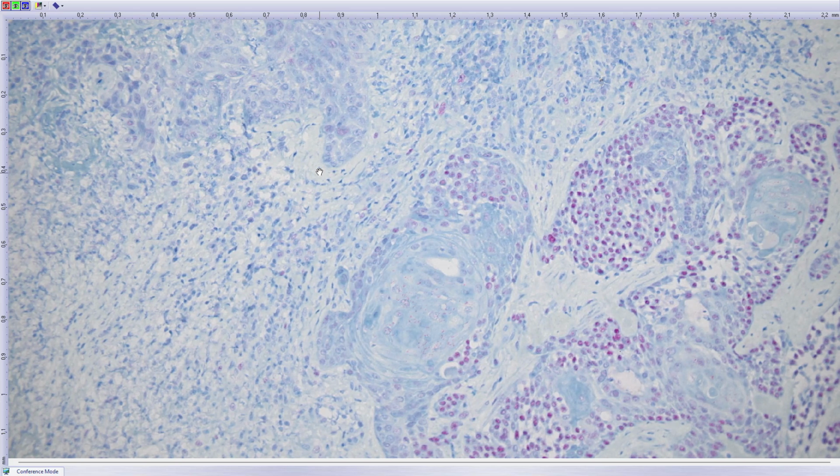This is metaplastic benign pleomorphic adenoma of the oral cavity. And all these cases show that diagnosis of even very common pleomorphic adenoma may be difficult in the oral cavity, particularly because of lack of capsule and because of possible ulceration and metaplastic changes. So that's all from my side for today.